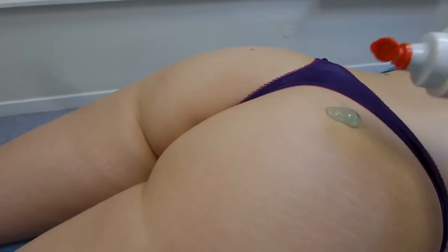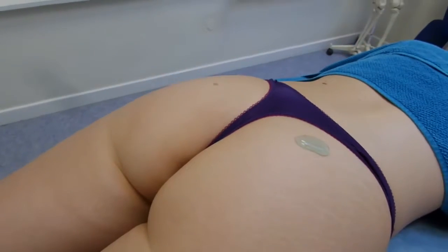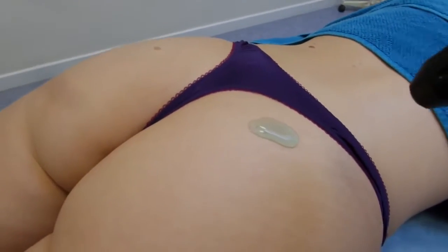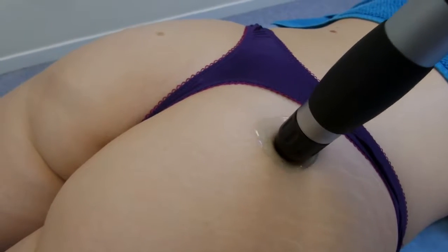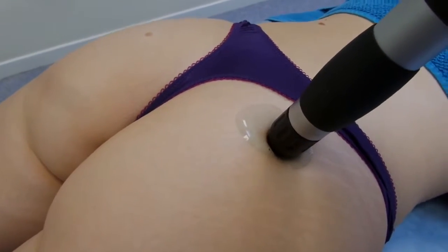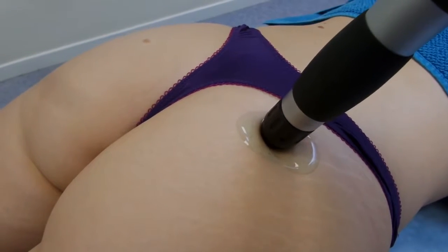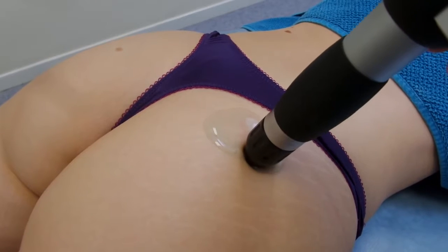We're going to do some trigger point spots, and then we're going to switch and do a general massage over the whole gluteal area. We've applied some gel to the gluteal area and spread the gel out. We could have used oil, as this is a concave head, not a convex head. We'll start the treatment and apply 200 shocks to one area.